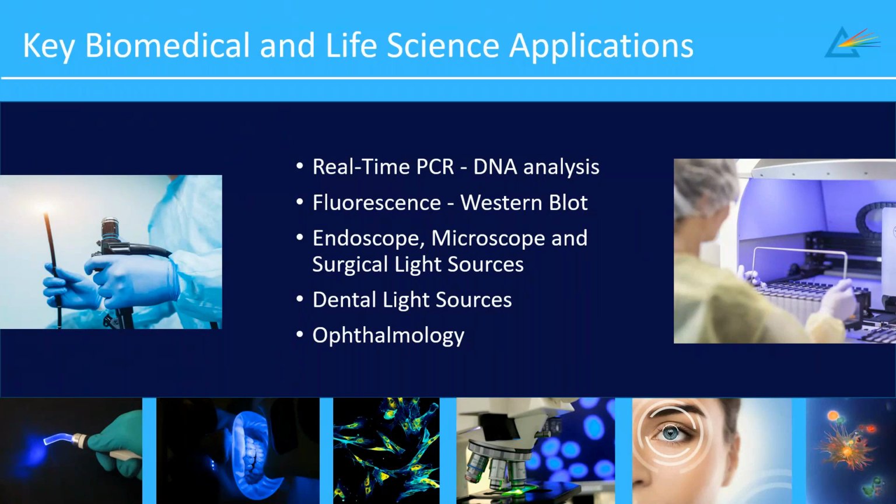In other cases, illumination supports direct visualization. Examples include endoscopy, surgical imaging, microscopy, ophthalmology, and a variety of clinical imaging systems where image quality and contrast are critical. Although these applications serve very different purposes, they all depend on the ability to deliver the appropriate light to the target in a controlled and, importantly, repeatable manner. As biomedical instruments continue to incorporate more imaging and analytical capabilities, these demands placed on illumination systems continue to grow.